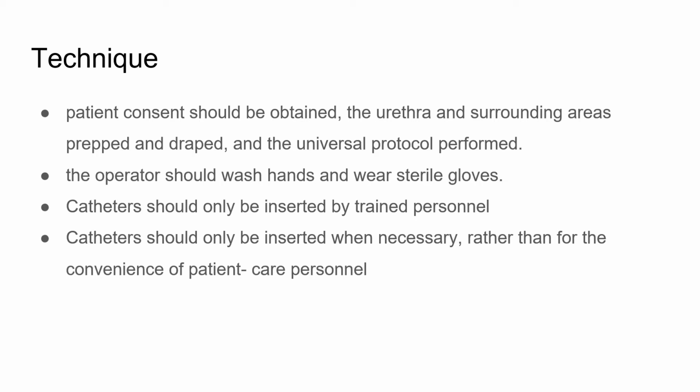Then catheter should only be inserted when it is necessary. So if a physician, a urologist, or a surgeon feels that the patient has to be catheterized, then only it is suggested, rather than for the convenience of the patient care personnel. So it is not suggested in a condition where the patient care personnel say, catheterize them so that it is easier to look after them. As we have identified, long-term catheterization may cause many complications, including infections. So this is not advised.